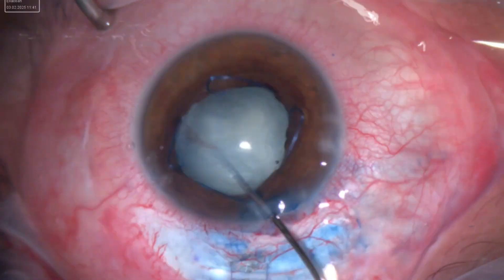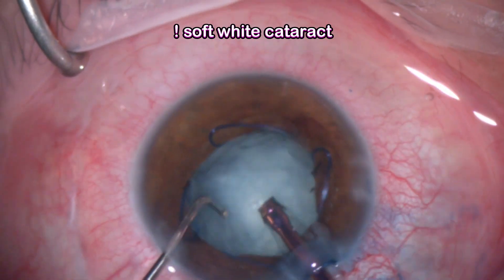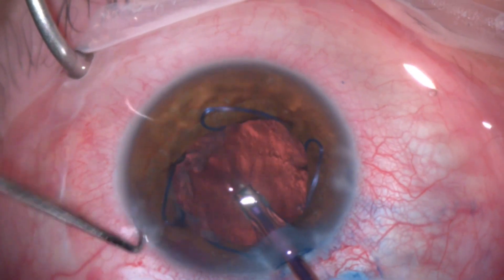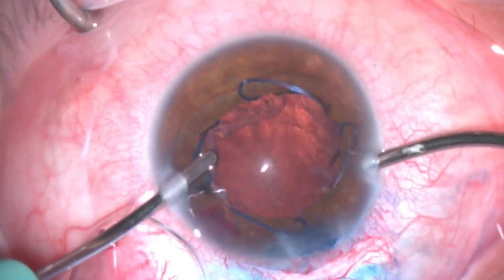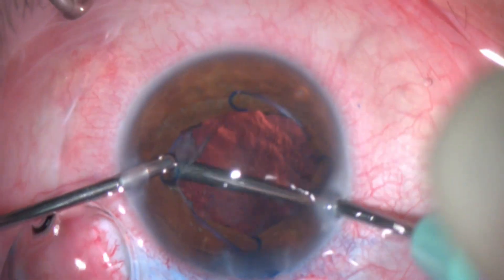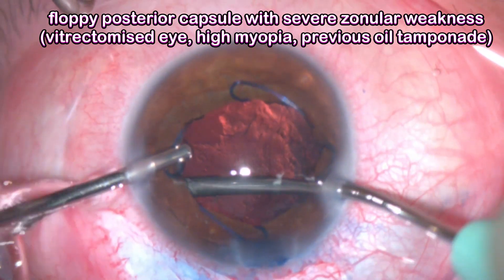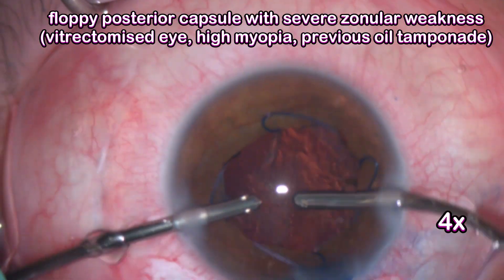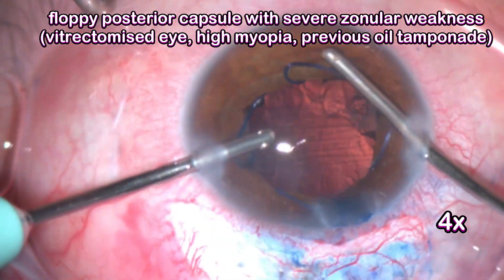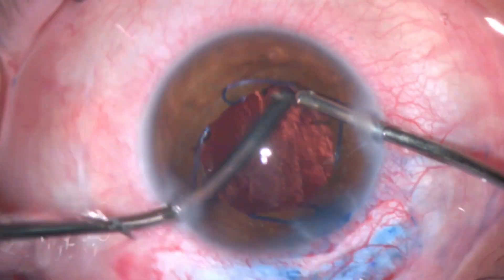Moving to remove the cataract — a little hydrodissection. This is a young gentleman so the cataract is quite soft, and it came out with almost pure aspiration. I prefer bimanual I&A in this scenario as it works better and more efficiently. The capsule was really floppy, likely due to the combined effect of previous vitrectomy, silicone oil tamponade, high myopia, and extensive zonular weakness.